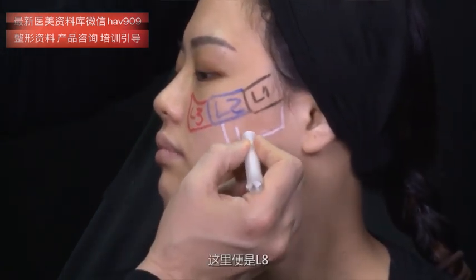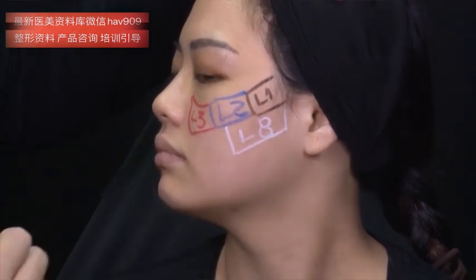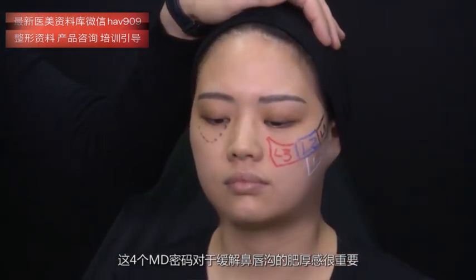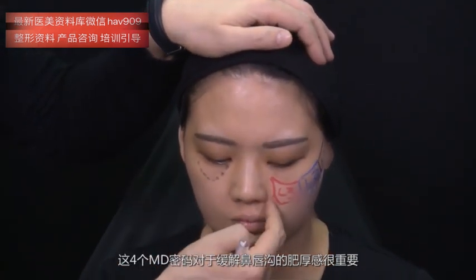So here is L8. So these 4 codes, 4 MD codes, are very important to release the heaviness over the nasolabial folds.